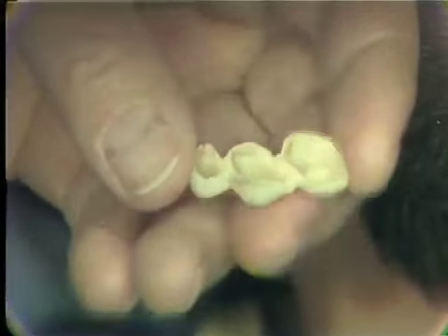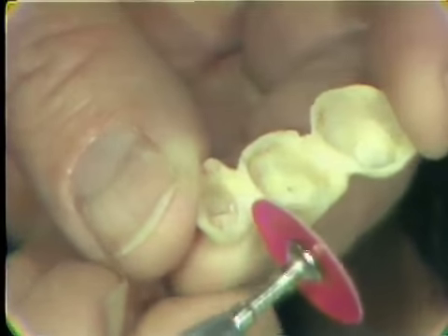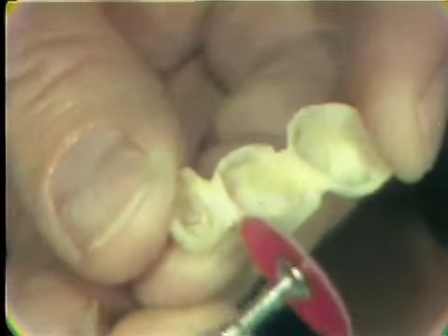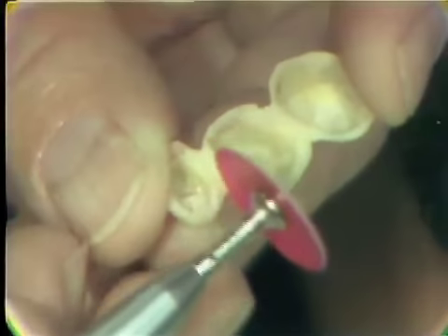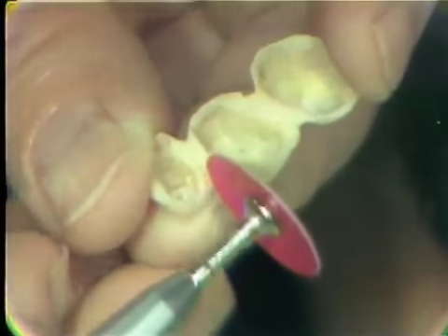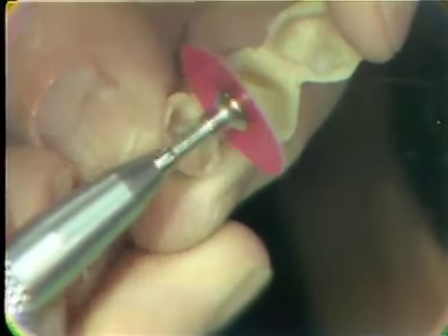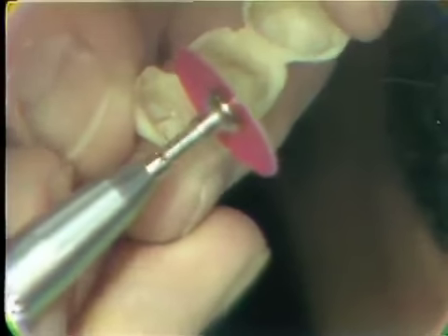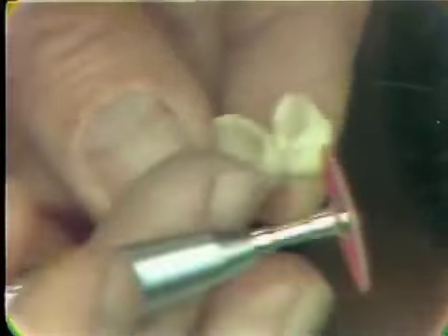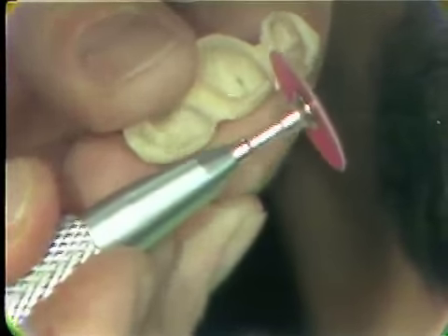We can remove the temporary from the shell and trim away the excess flash with a sandpaper disc. Be sure to open the interproximal areas of the temporaries so that the gingival tissue can be kept clean. This is probably the worst area on the temporary, the proximal areas. These are generally too wide and too thick.